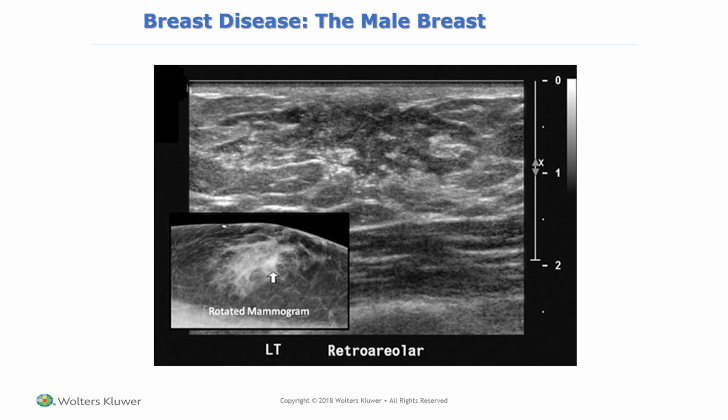So here's an example where we're looking at it on mammogram. You can see that it's a radio-opaque area. And then as you correlate that with the ultrasound, you see the ultrasound here has that dendritic type appearance. So this is a more mature appearance.